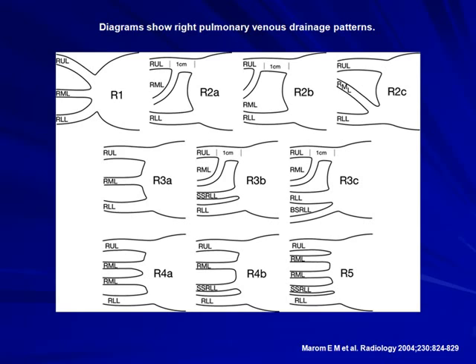Well, isolation of pulmonary veins is the mainstay, the primary electrical endpoint that we strive for with ablating atrial fibrillation. So knowing where those veins are, where the ostium is, and what constitutes vein is probably deeper than you realize, and is actually pretty important to know. In this particular case, there's a lot more to the right veins than actually meets the eye.